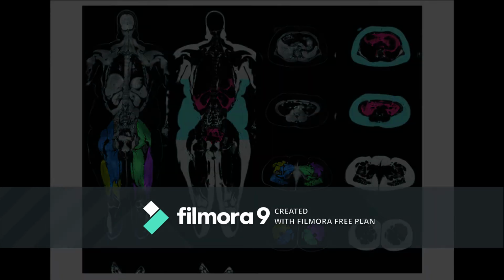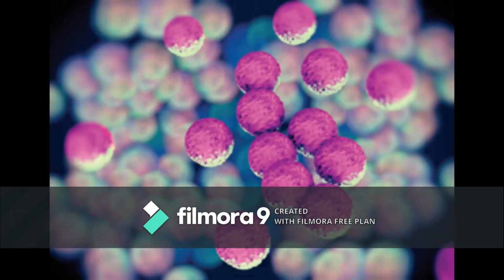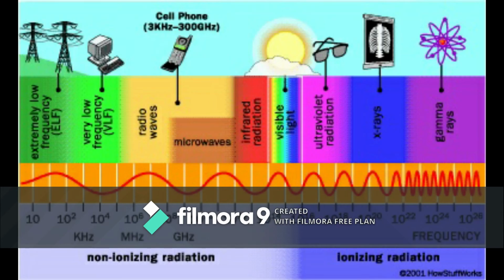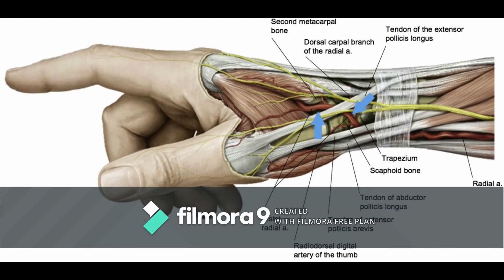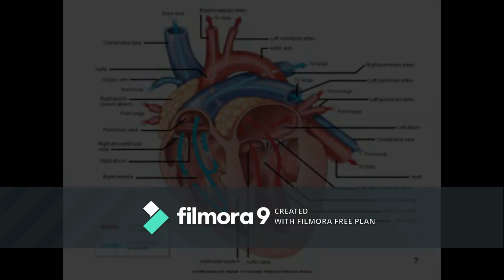These images can provide information to physicians to allow for better diagnosis and discover a wide variety of diseases and conditions. MRI also does not utilize any ionizing radiation. Therefore, patients are not exposed to the harmful effects of ionizing radiation. It requires little patient preparation and is non-invasive. It provides excellent precision of anatomic structures from inherent high level of contrast resolution.